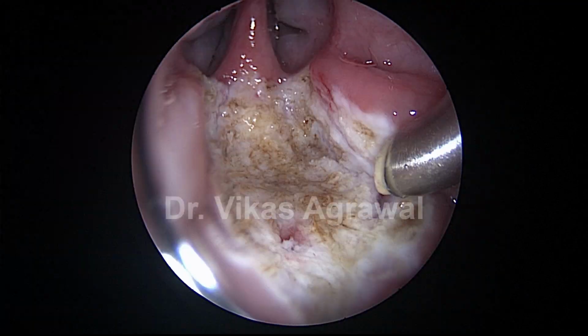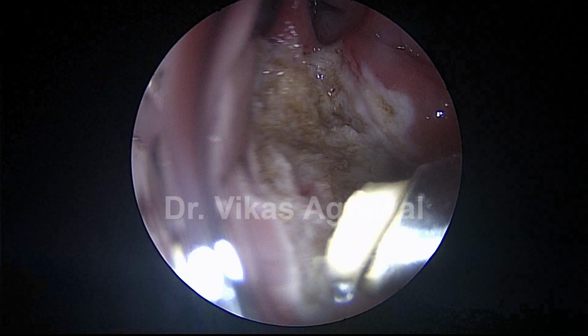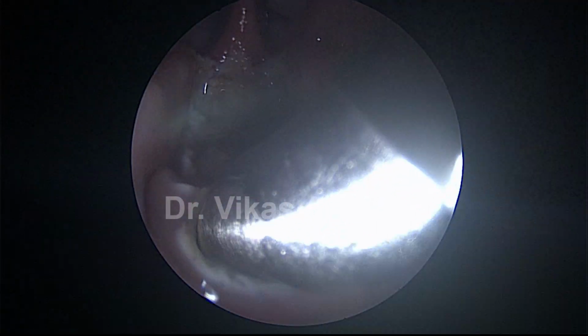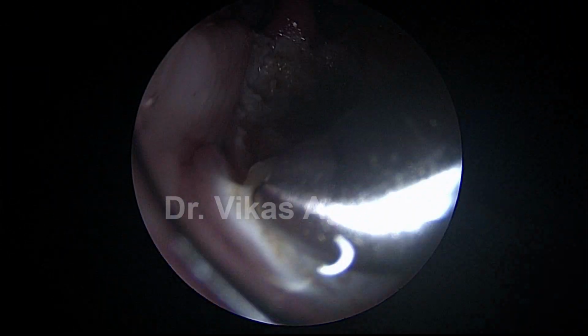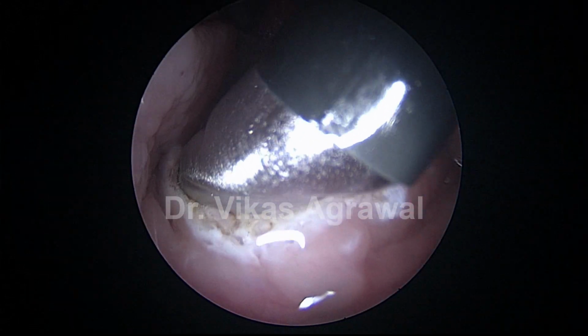And that's the Torus tubarius behind this. This is the Fossa of Rosenmuller. We'll not go deep into the Fossa of Rosenmuller. I'll first remove all this bulk behind the Torus tubarius on the right side of the patient.